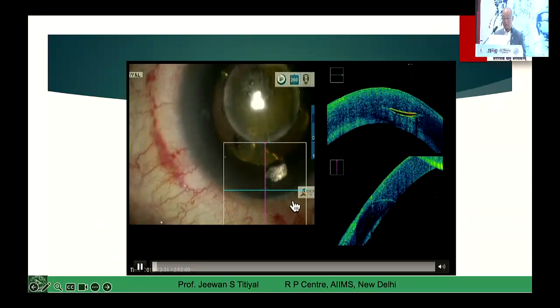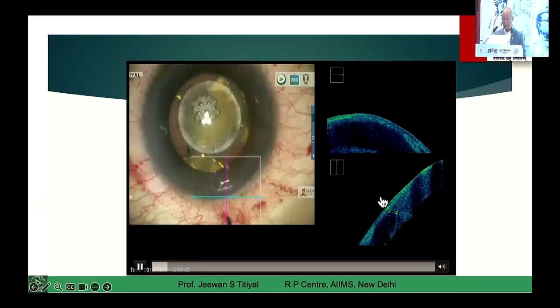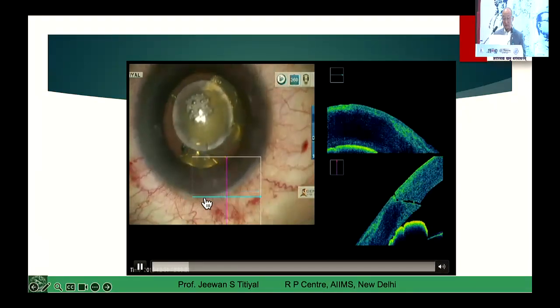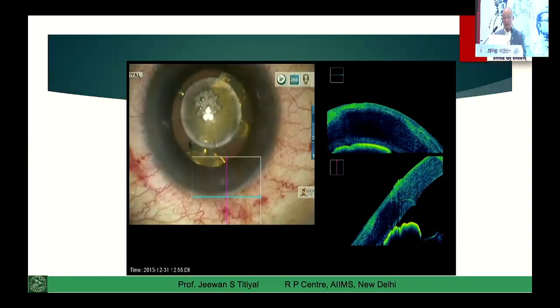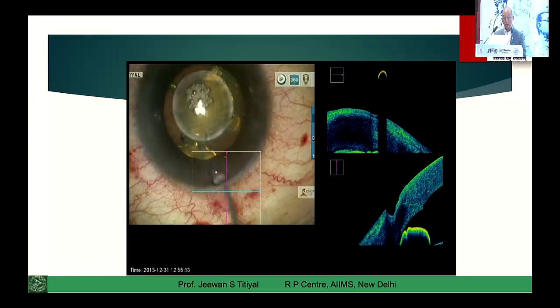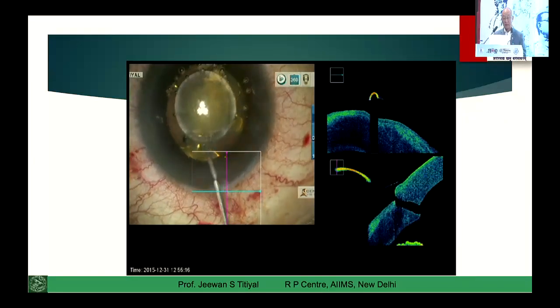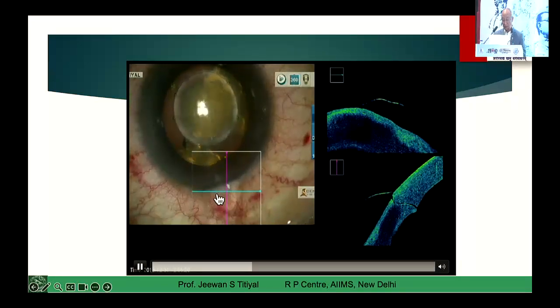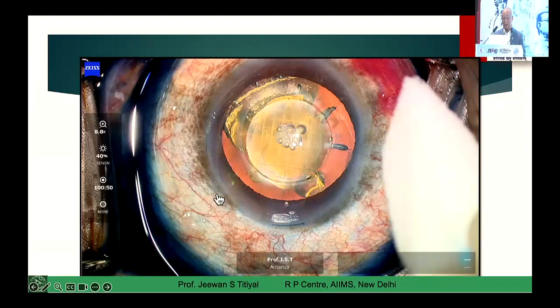You see here, this is the main incision, a little bubble here. We have a triplanar incision there. This silver lining gives the idea that this is the incision area. So first you have to open vertically, then go tangentially, horizontally towards the anterior chamber. This can be opened very, very easily. So if it is a clear corneal, the things are simpler. But if you have a little limbal incision, the things can be difficult in some cases also.